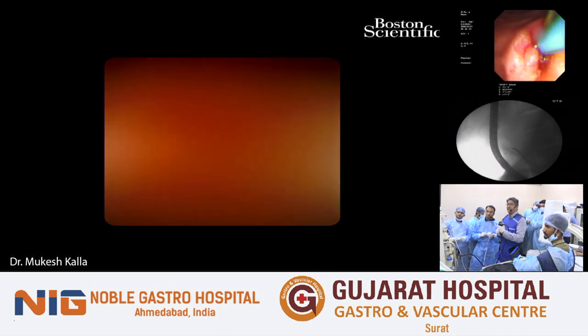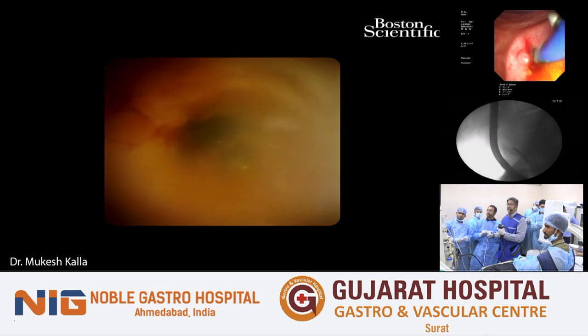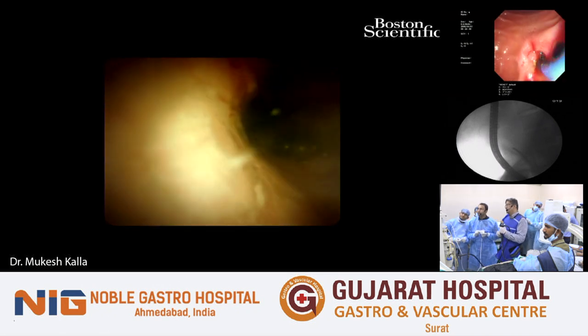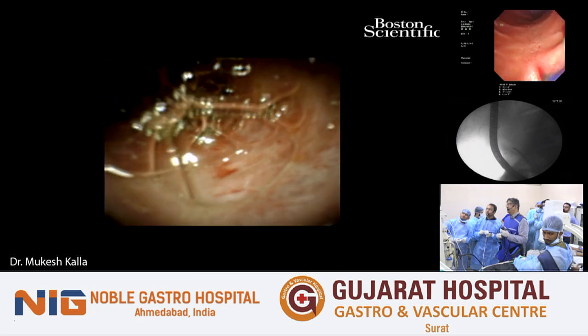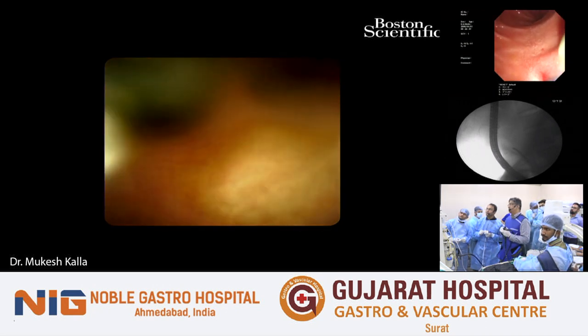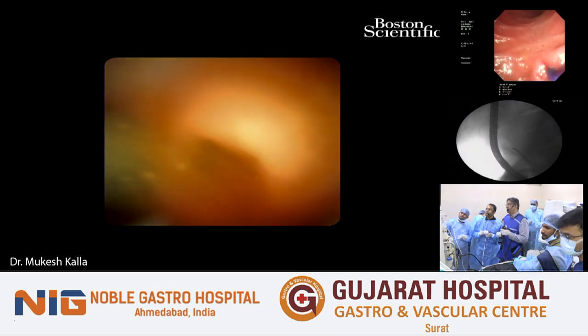So just for the knowledge of the delegates in the meeting, I hope this thing is done. Yeah, it's all clean now. It's absolutely clean now. No, it's wonderful. I think this is the hilum and there is no stone.